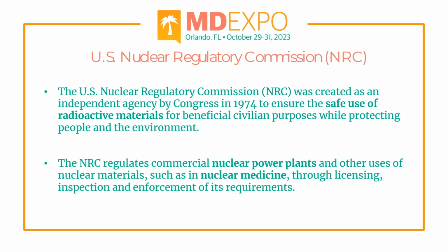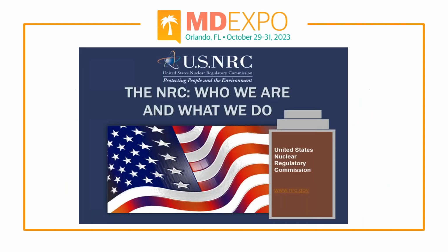All right, so let's talk about the USNRC, the Nuclear Regulatory Commission. It started in 1974 for the safe use of radioactive materials. Now, if you don't have a nuclear medicine department, you probably don't have to deal with it. Obviously, we're not dealing with nuclear plants, but what we are dealing with is nuclear medicine, your gamma camera and all that equipment that you have in your nuclear department, and they have certain requirements for regulating that. You've heard of the hot lab and all that.